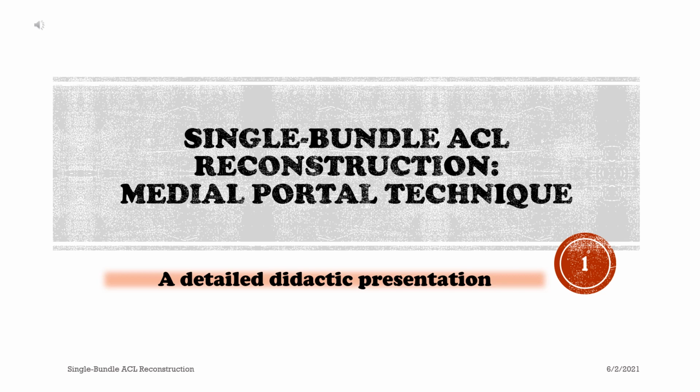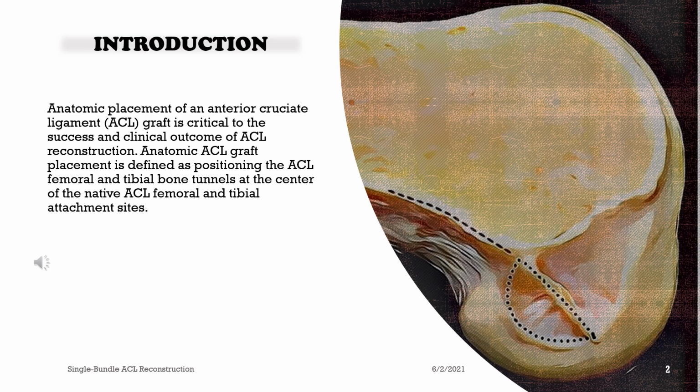Single bundle ACL reconstruction, medial portal technique. A detailed didactic presentation. Introduction.